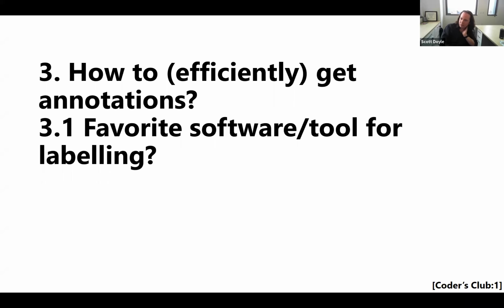I find that when we start with people, the first time you ask them to do something, they're very reluctant, but after they get used to using the interface, it really gets smooth. And there's much lower activation energy required to get started. But you really have to be prepared and know what you're doing and not fumble around. You have to have your protocol ready and have everything completely set up and documented, and not just learn as you go.